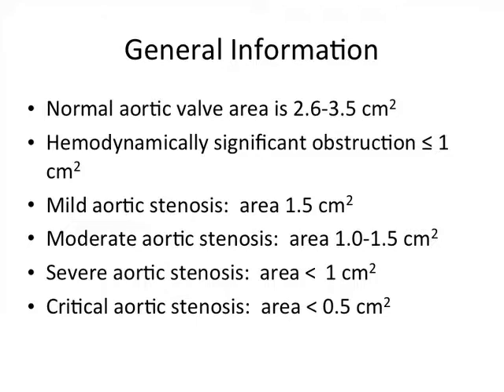One caveat is that calculated aortic valve areas are estimates based on the assumption that the patient has a good cardiac output. Patients with poor ventricular function and low cardiac output can thus have seemingly low gradients across the aortic valve despite having severe aortic valve stenosis. Their weakened left ventricles cannot muster enough pressure to overcome a tight stenotic aortic valve. There are other methods of evaluating aortic stenosis in patients with poor ventricular function. This will be reviewed in a later open anesthesia intraoperative TEE case of the month.